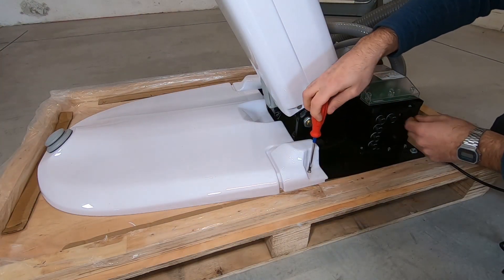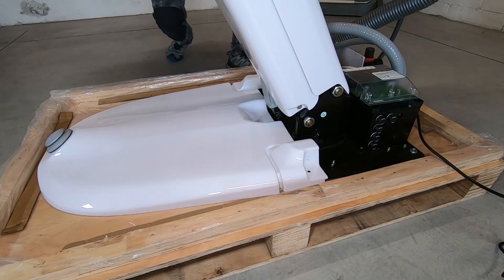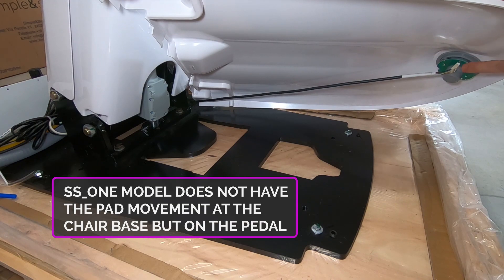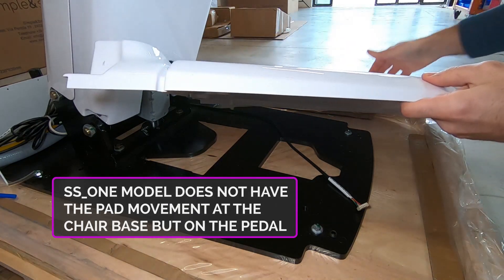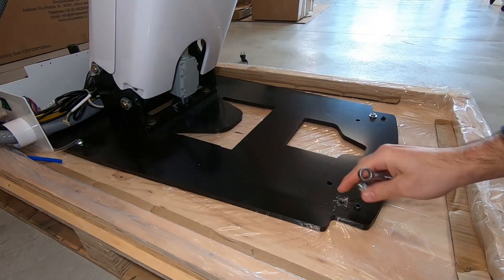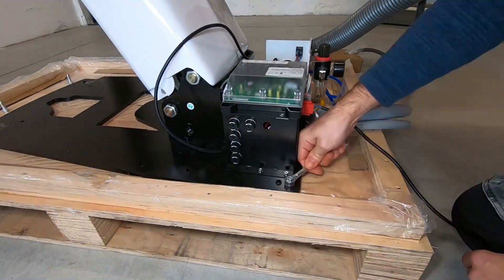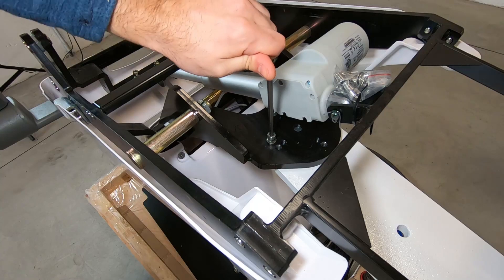Remove the rear cover at the chair base. Disconnect the connector of the movement pad. Remove the screws fixing the unit to the pallet.